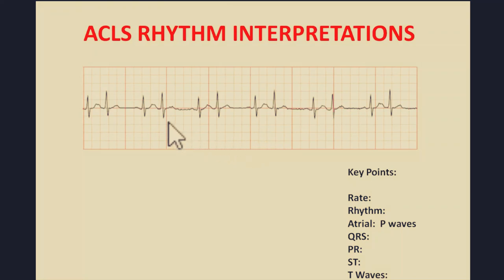Here is an example which is like a normal beat and an atrial premature beat. This is an atrial bigeminal rhythm, which is a little more advanced. That's why I said we need to be observing these irregular heartbeats, because they can progress to more serious types of rhythm problems such as atrial flutter or fibrillation.